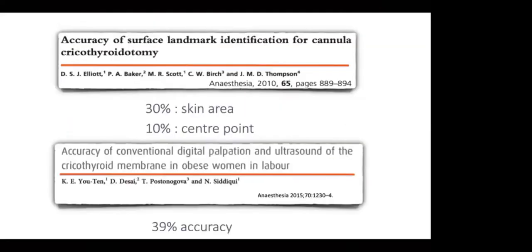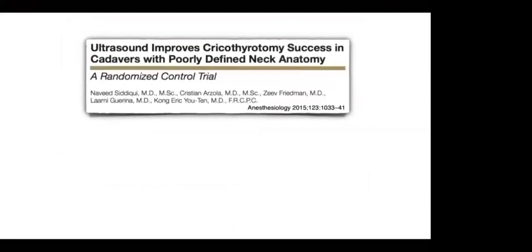Comparing conventional palpation with ultrasound, it is clear that ultrasound improves accuracy across all patient groups. This includes pregnant and obese patients. Ultrasound not only improves accuracy, but it also does improve outcomes.